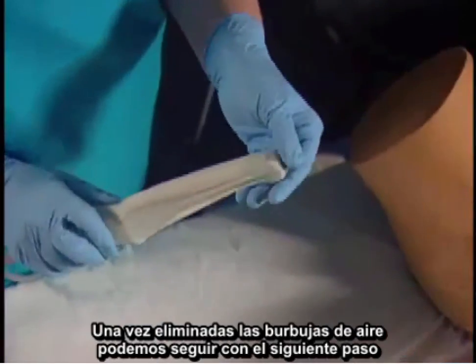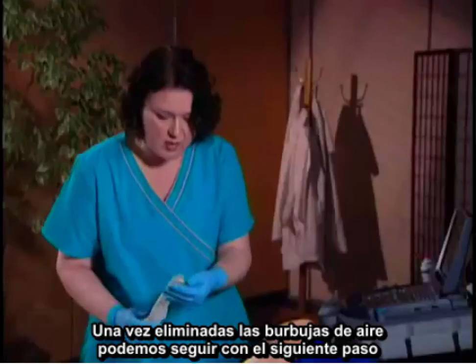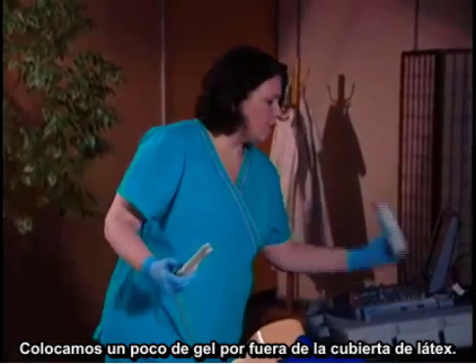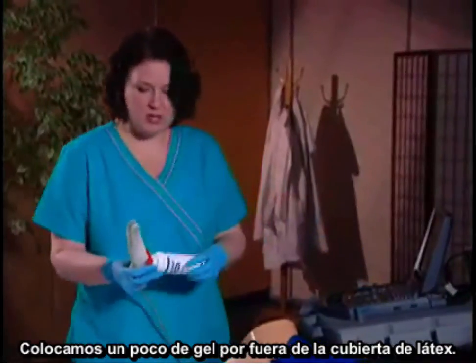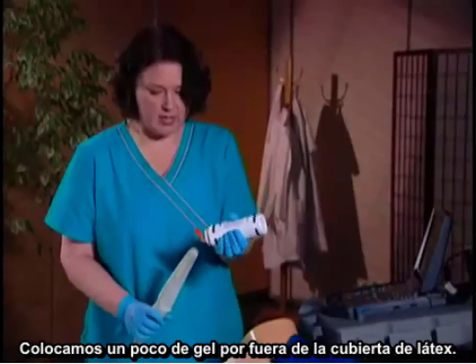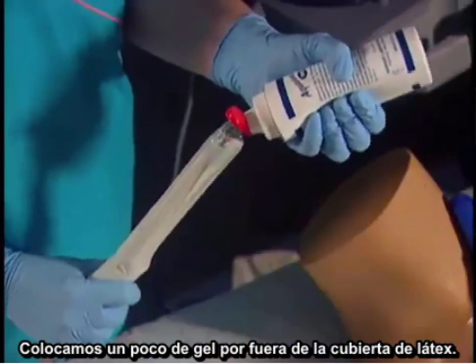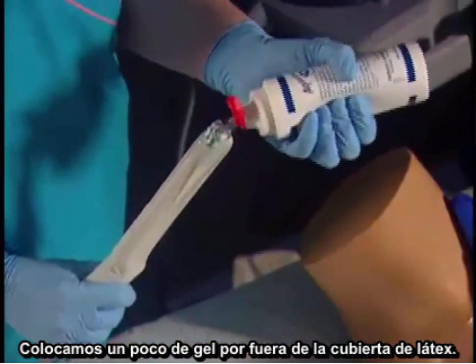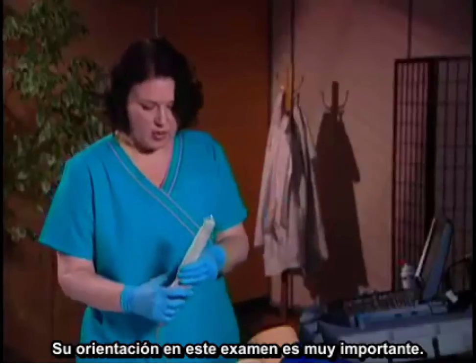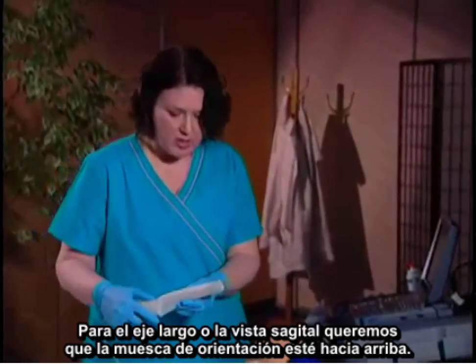Once you've got the air bubbles eliminated, you can move on to the next step. We're going to put a little bit of gel on the outside of the latex cover now. And again, your orientation for this examination is very important.